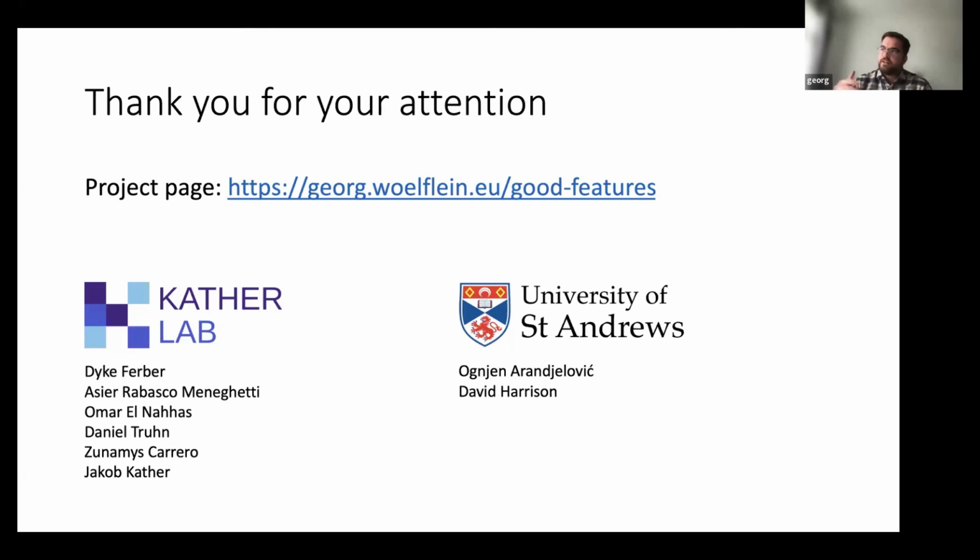So don't augment your images, because that actually increases the computational complexity even more. For each augmentation, you're going to have to run that through the feature extractor as an additional pre-processing step, where usually you only need to run your original patch and get the embedding vector. If you do image augmentation, you then for every patch maybe get 30 different feature vectors because you're doing 30 different augmentations, and you need to do that all before training. So that's significant computational overhead.